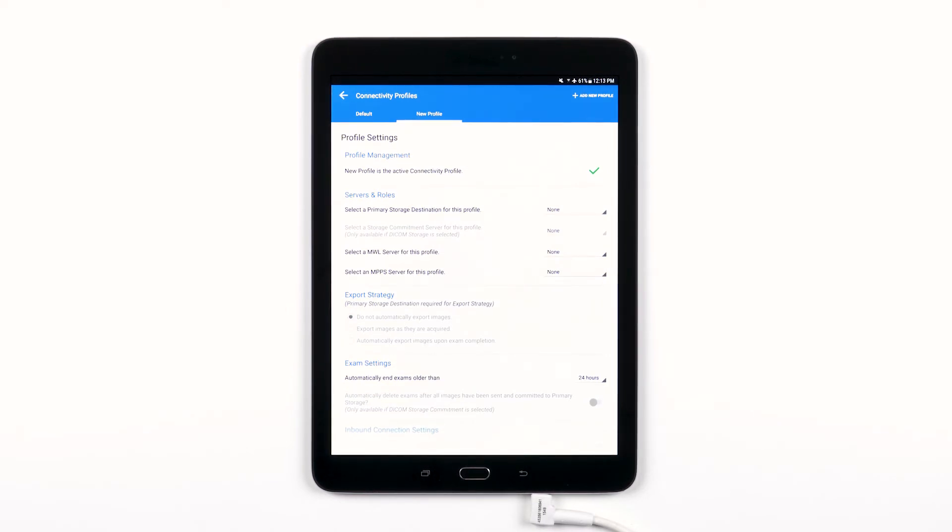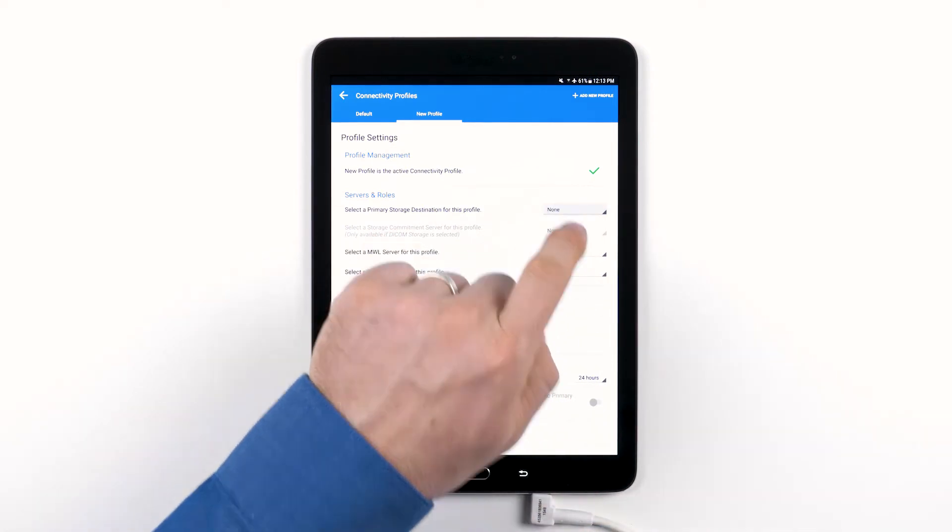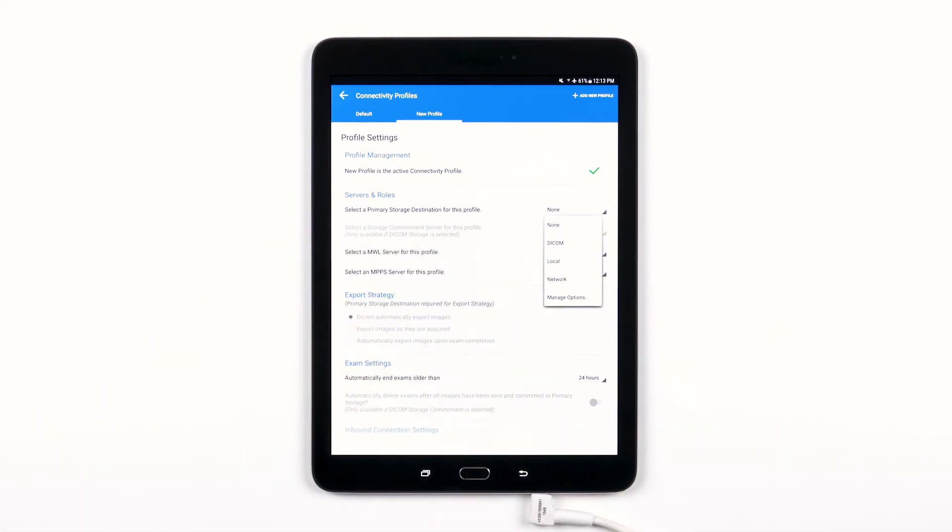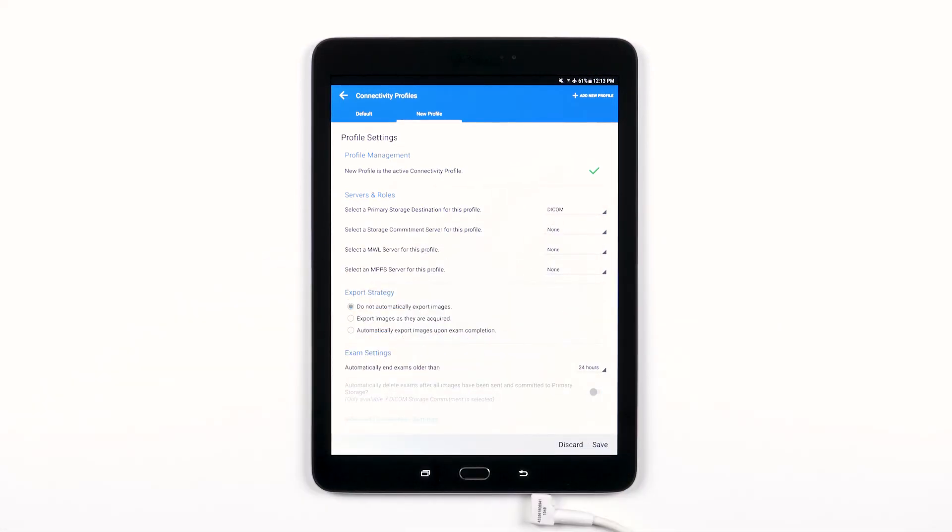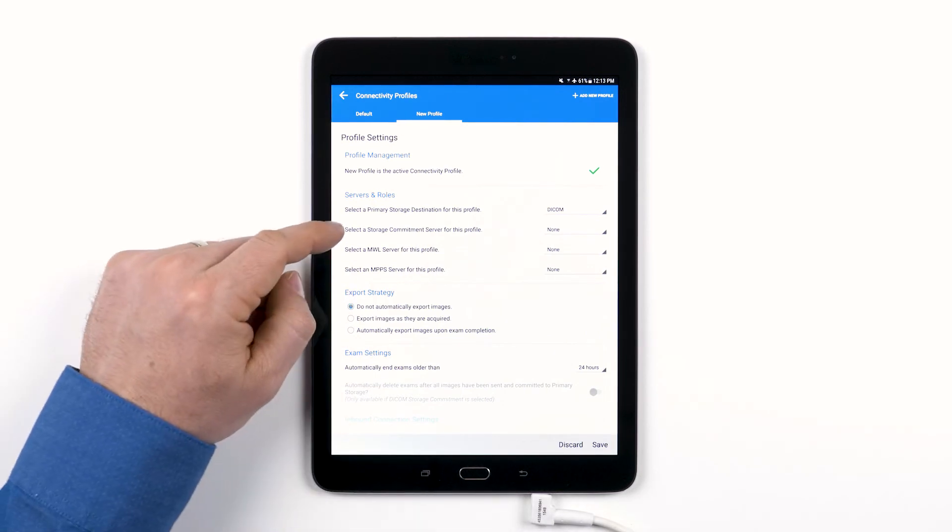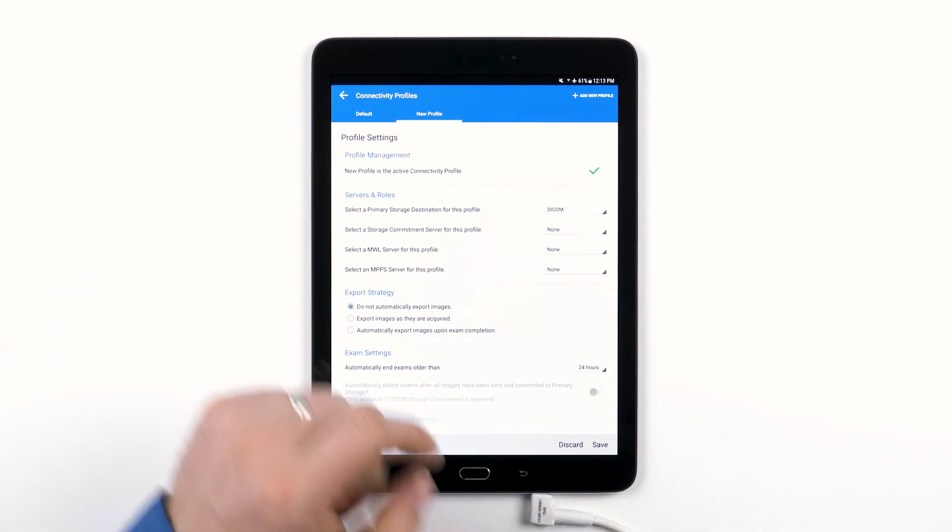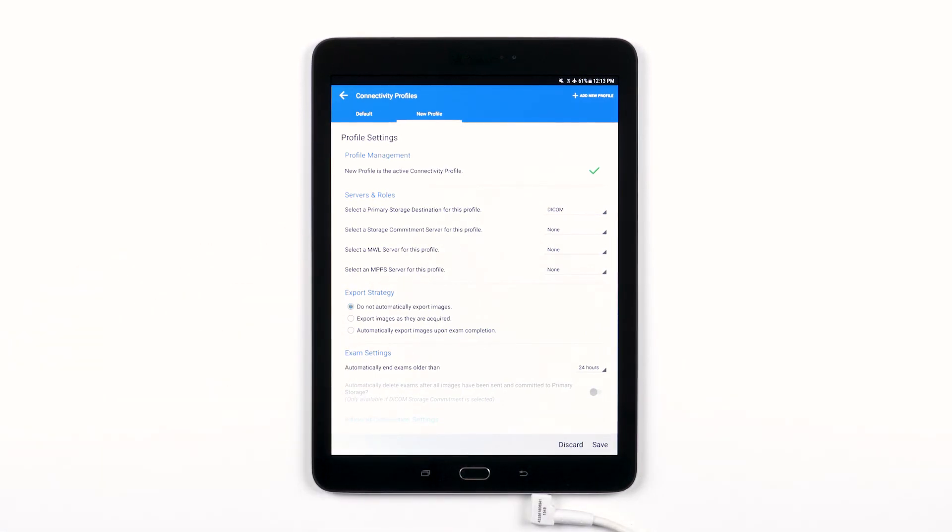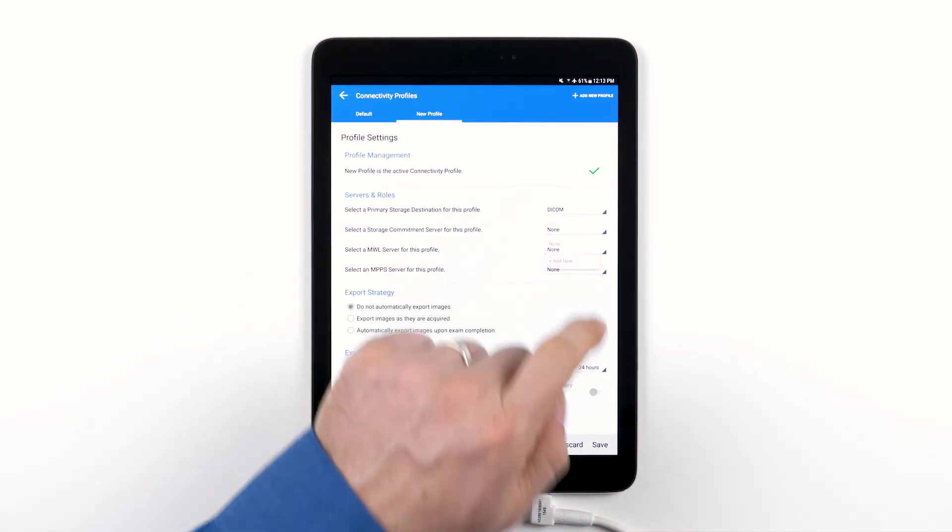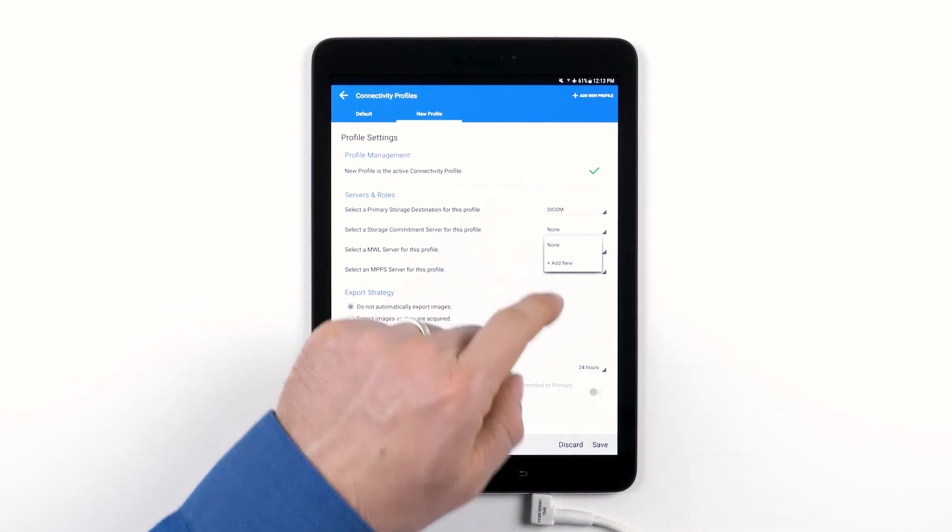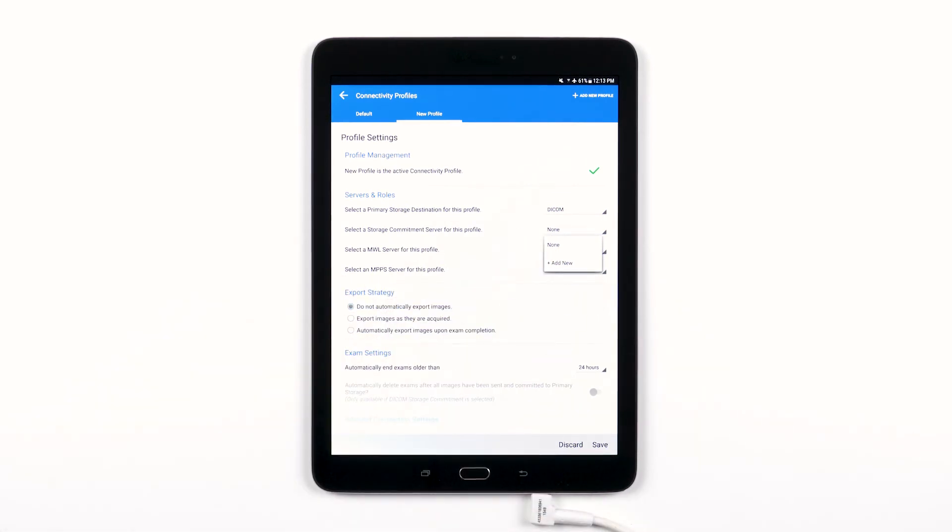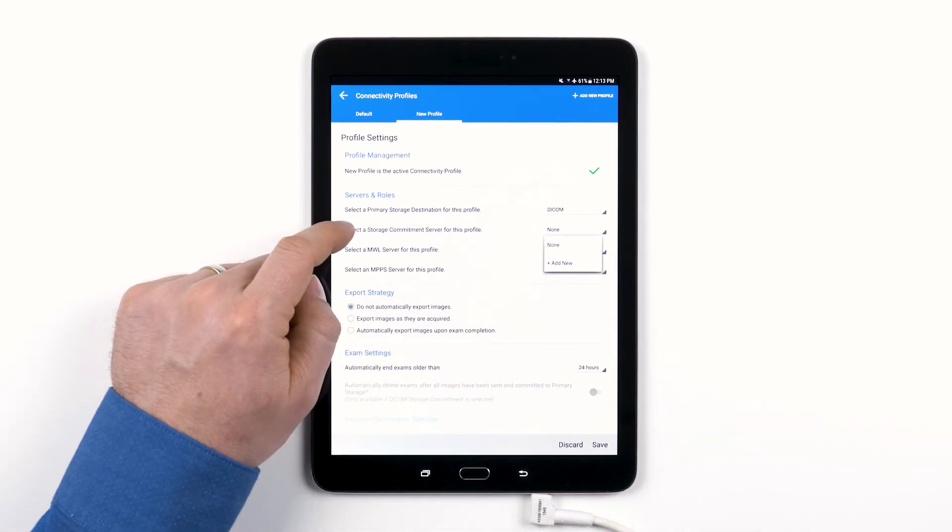This gives me the option to select a storage commitment server for this profile. This option will be grayed out for other export destinations. If you have a storage commitment server already set up, tap where it says None. Your server will show up here. Otherwise, tap Add New to go through the process to set up a new server.